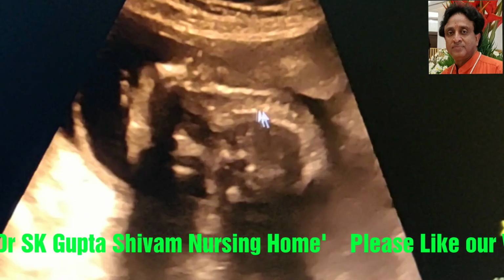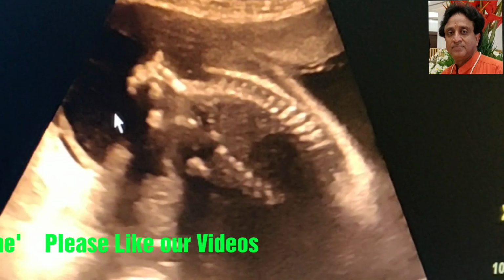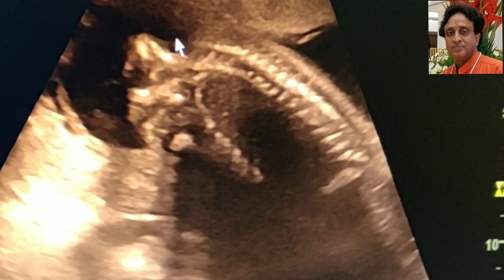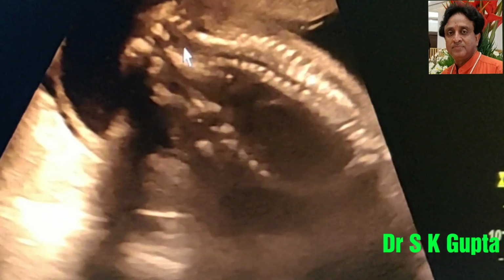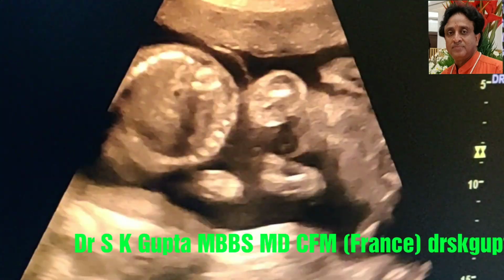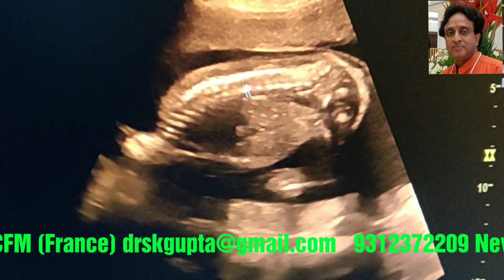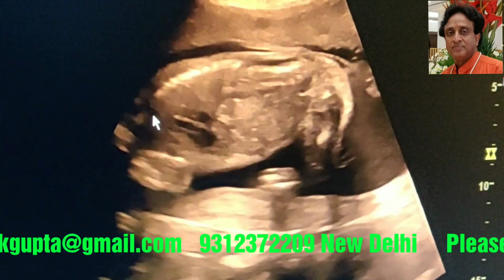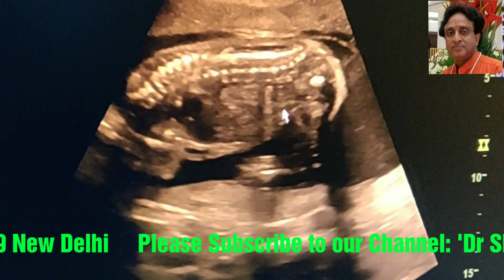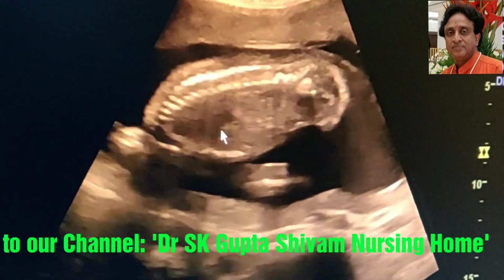This is the spine, and I am trying to focus on the brain tissue which is hanging. This is the brain tissue which is hanging, and this is exencephaly, and you see that this is the spina bifida defect over here in the cervical region. The rest of the spinal cord appears to be normal. Focusing on the anencephalic fetus, this spine is normal here, but the spina bifida is over here, and the limbs appear to be normal, the heart appears to be normal, the bladder can be seen. There is no evidence of pyelectasis.